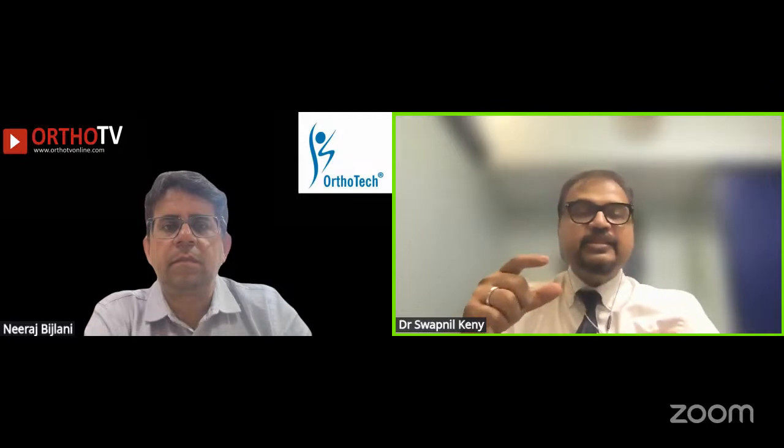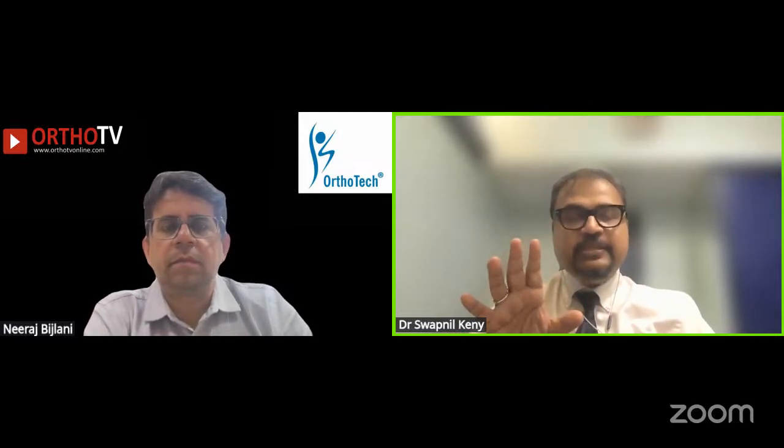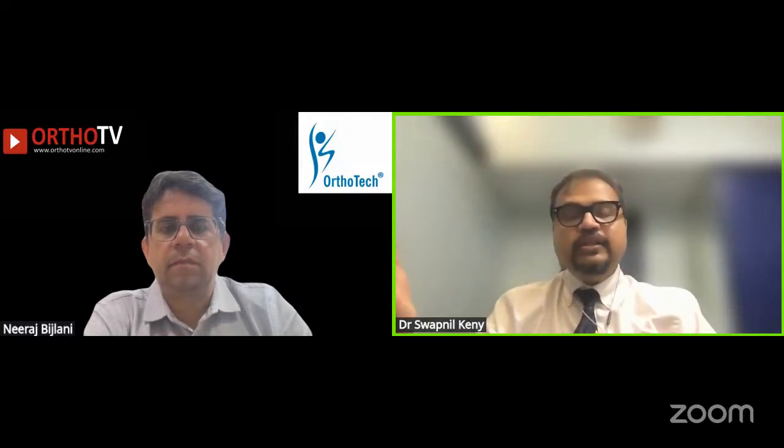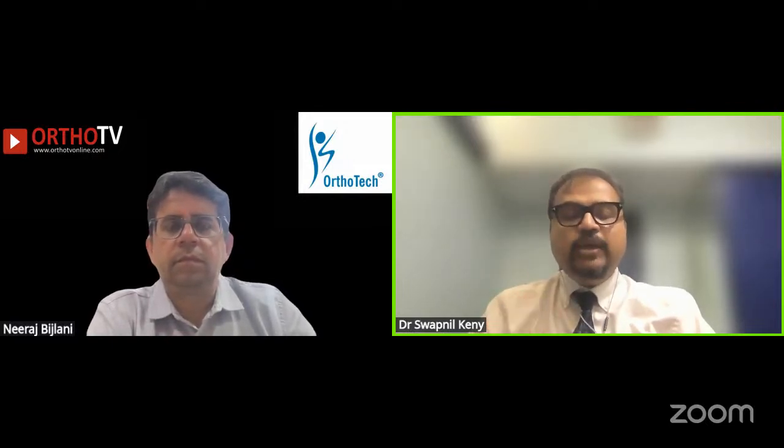So what it does is it just aligns the distal and the proximal fragment. And once that happens, it is still rotationally unstable because you are in internal rotation. So when you get to neutral rotation, and once the fragments are interdigitated, you get a near total anatomical reduction. Then all you need to do is give some amount of traction, some amount of varus valgus, and you are able to get an anatomical reduction, and then you can fix it with wires. So that is what I do.